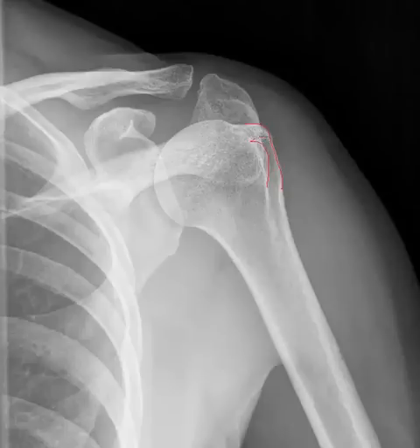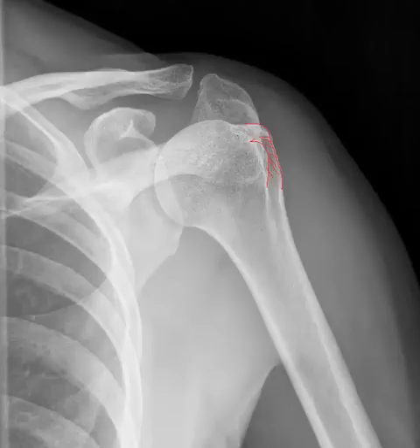Between the tuberosities is a more lucent area. This is the intertubercular groove, and the long head of the biceps tendon lives in this location. Other anatomy that can be seen includes the humeral head, humeral neck, and humeral shaft.